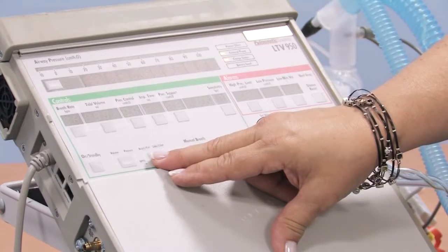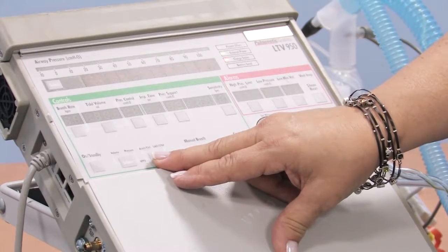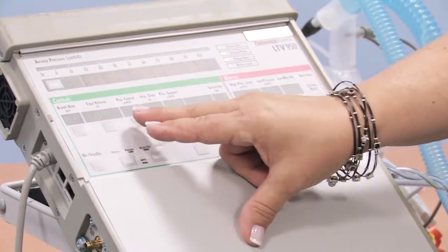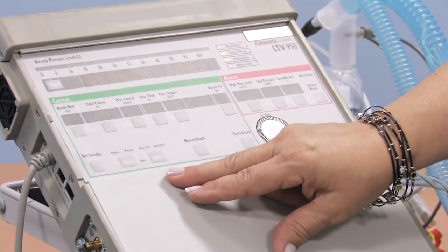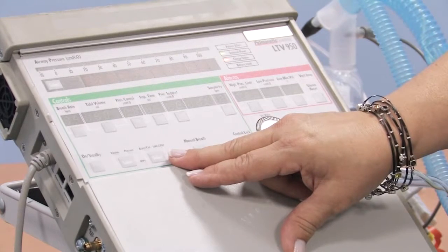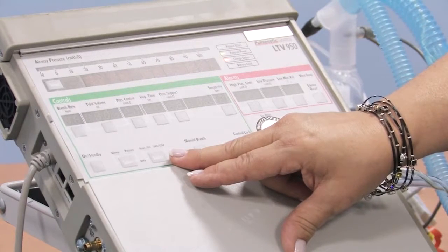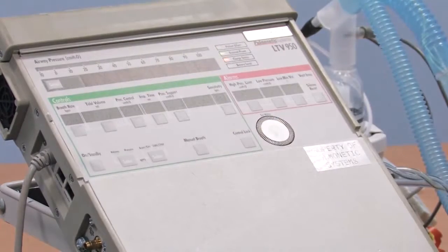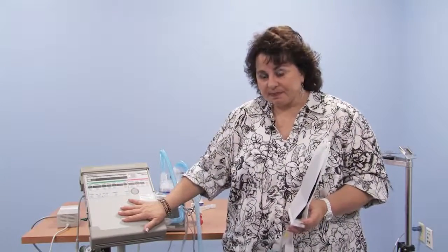We have the assist control mode, which means that every breath the child receives is going to be either the tidal volume or the pressure that your doctor prescribed. Now the machine may say 10 breaths a minute, but if it's in the assist control mode, they will get 10 breaths a minute minimum, and any other breath they desire and trigger will be that set pressure or tidal volume that the doctor has prescribed.